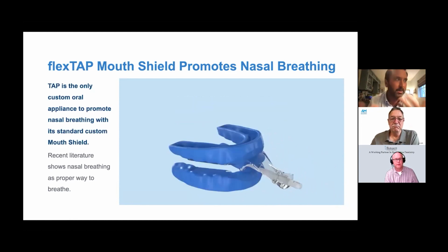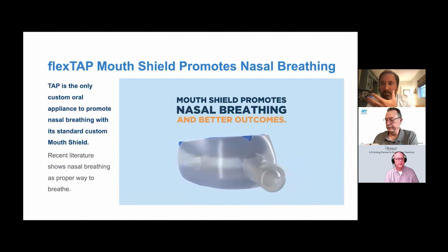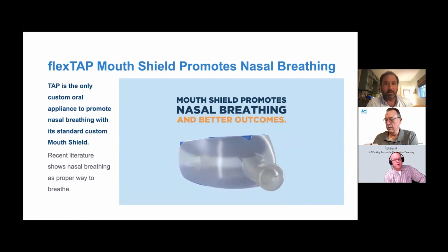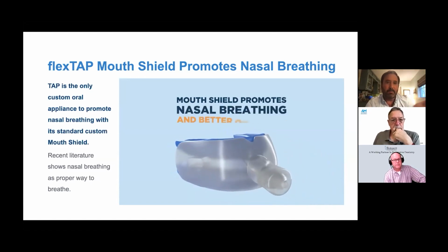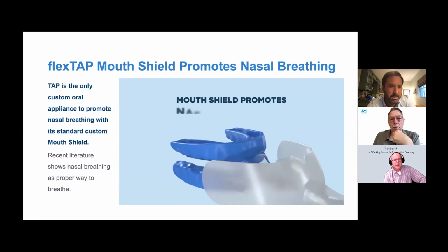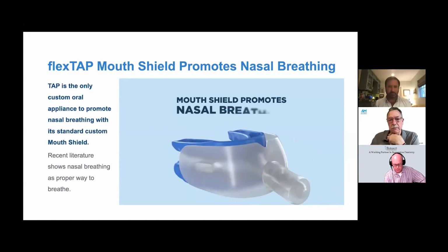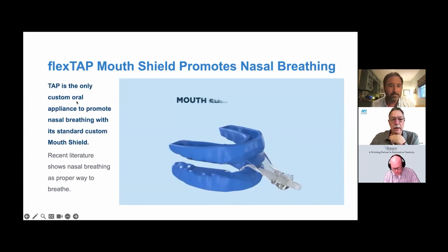And now that I've been wearing a mouth shield, I can't imagine going back without one. You wake up every morning with, again, this is personal experience, no nasal blockage whatsoever. Your nose is open. There's never any drainage. It's incredible what a mouth shield or something like taping can do for your nasal passages. We do add a little bit of saline spray to go with it. I won't say the brand because it's not appropriate, but a little nasal spray helps clear the nose before they go to sleep as well.